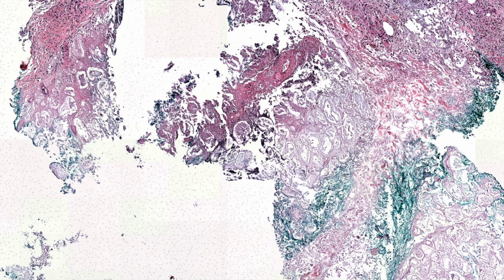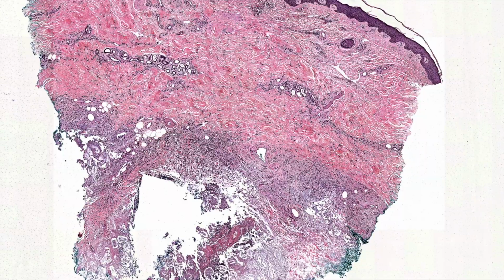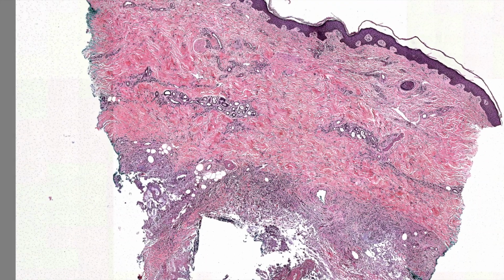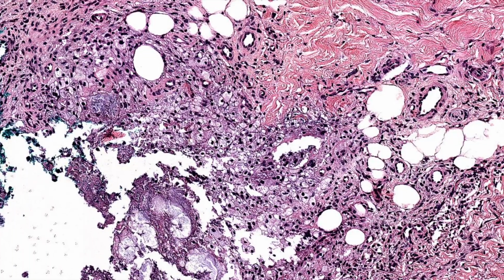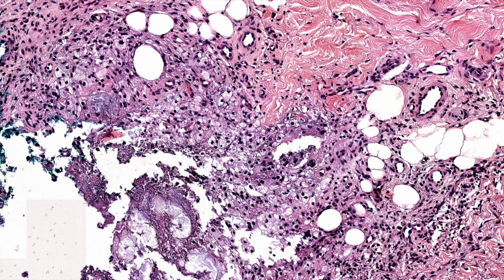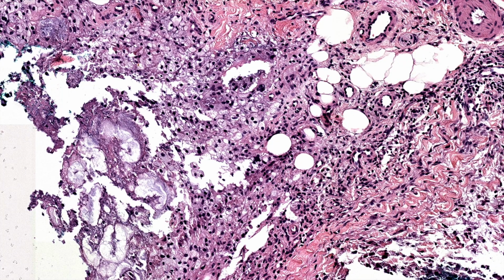So even a distant pancreatitis can leave this kind of pattern of fat necrosis around for quite some time, especially if it gets walled off and not cleaned up by the body. And then here's a little more typical foamy cell histiocytes like we see in regular fat necrosis. So, pancreatic panniculitis. Great. Let's see the next case.